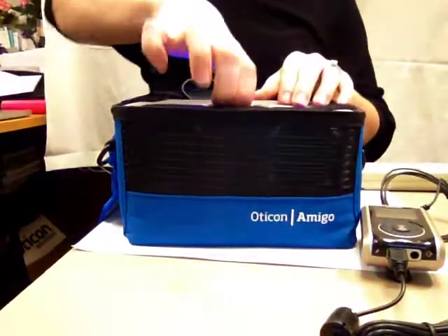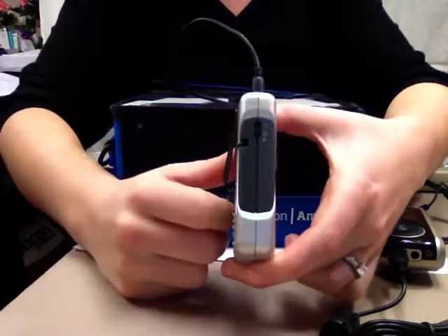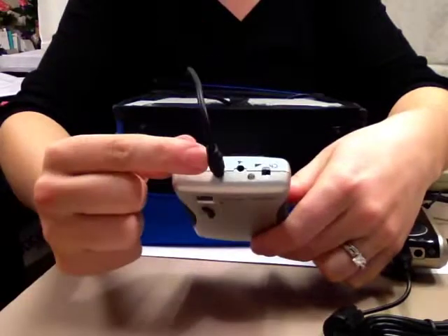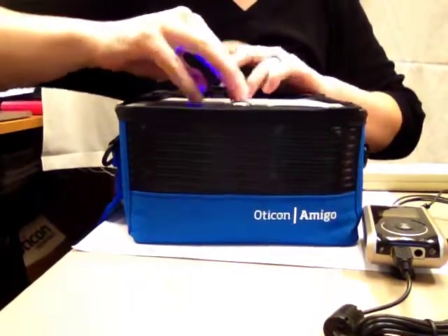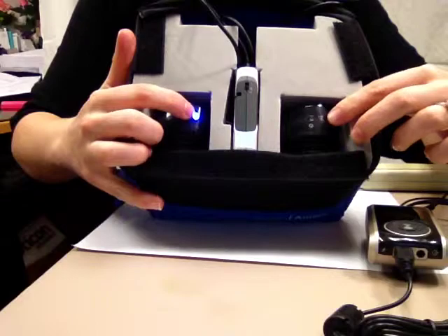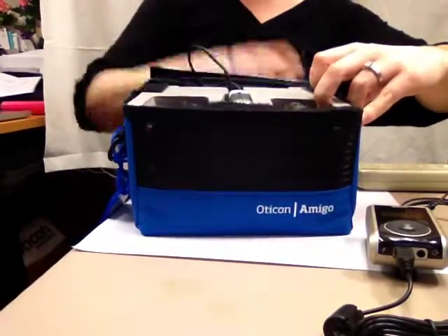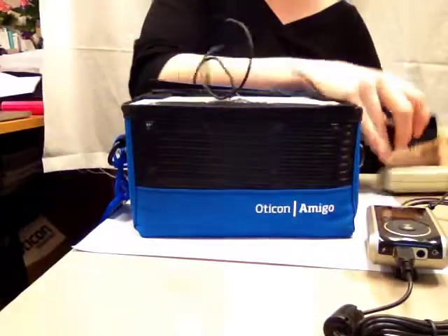Turn off the Oticon R5 receiver by moving the slider on the side from 1 to 0. Leave the cord attaching the receiver to the speaker box connected. Turn off the two speakers by moving both sliders to the outside. The charging cord is located in the speaker's box at the back. Plug this charging cord into a wall socket.